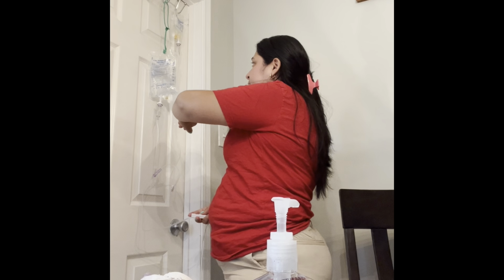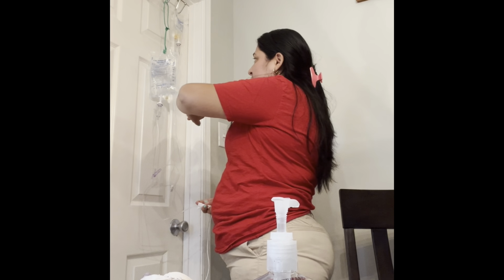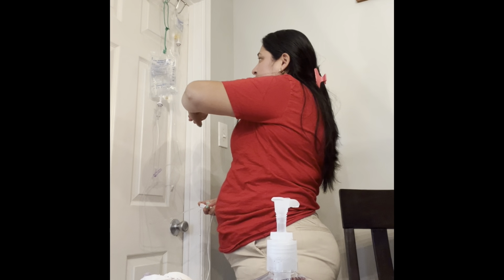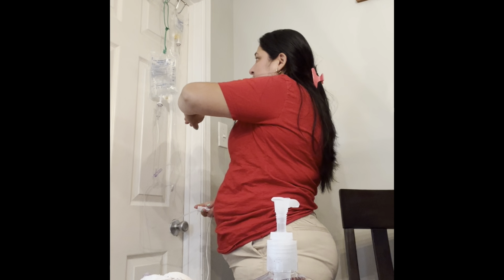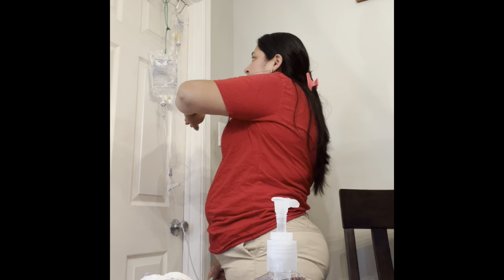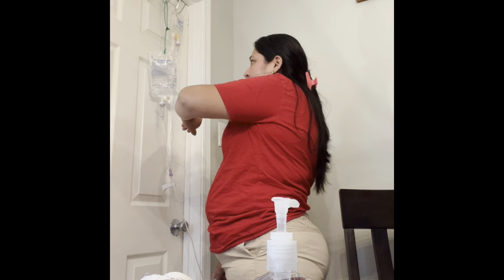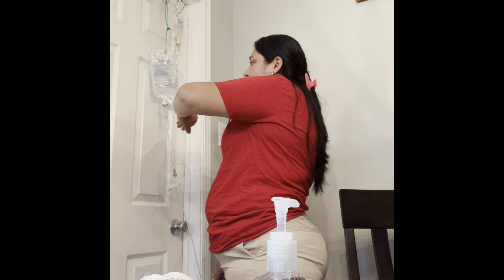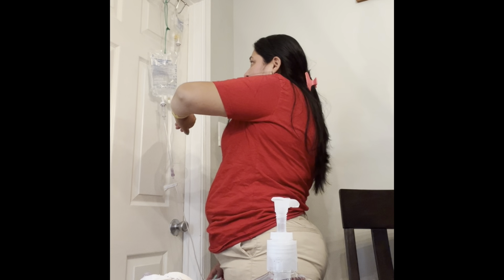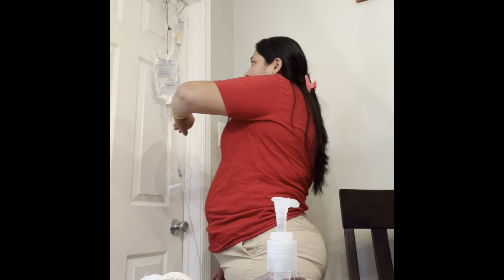Starting now, 1, 2, 3, 4, 5, 6, 7, 8, 9, 10, 11, 12, 13, 14, 15, 16, 17, 18, 19, 20, 21, 22, 23, 24, and 25. Okay, the rate is adjusted.